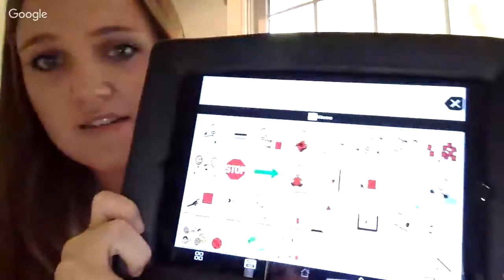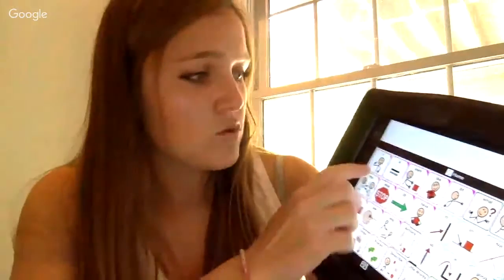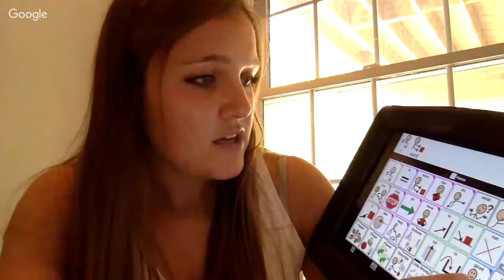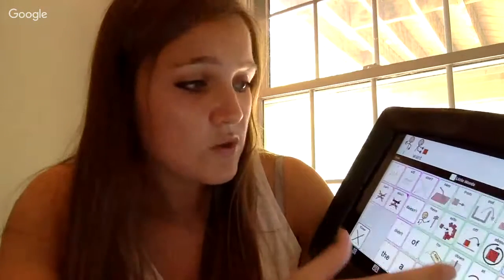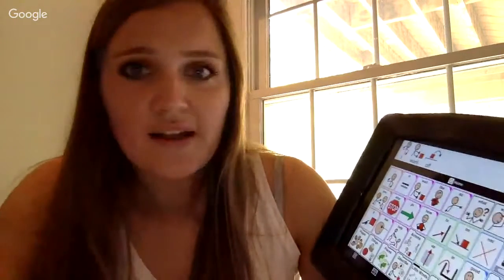I'm going to demonstrate now how to use Proloquo2Go. So this is the home page. I know it's kind of hard to see. But you can use full sentences, and it's really cool because when you click on like I want, you can click into a folder. So there's like little words. So you can say off. So like I want off.